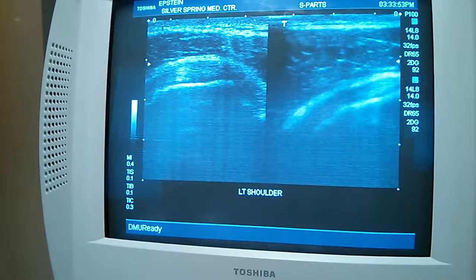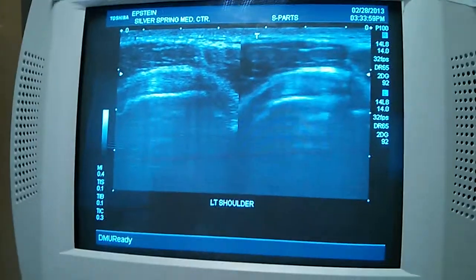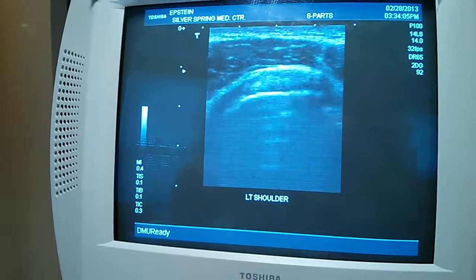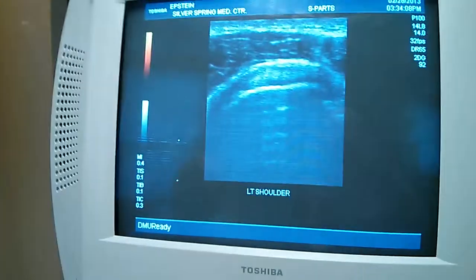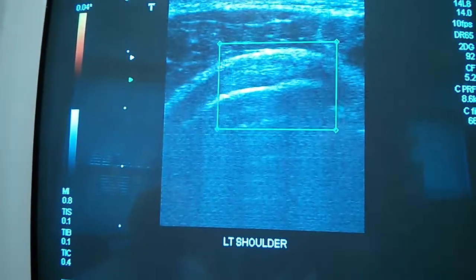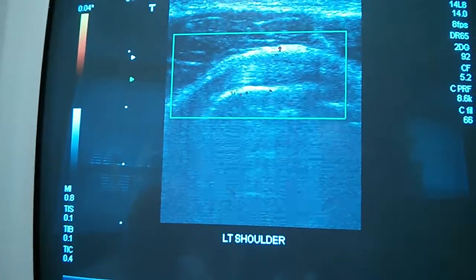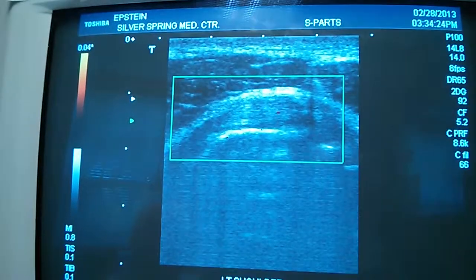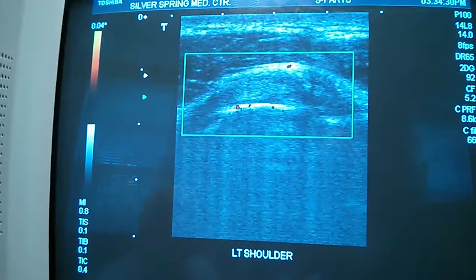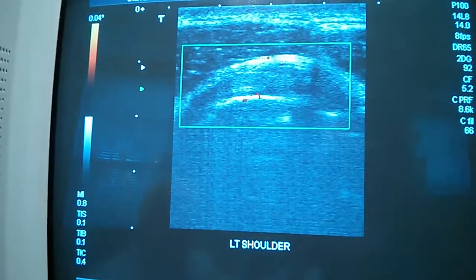The only thing that concerns me a little bit is the covering of the muscle. See the white line above the muscle? Yeah. This thing is a little bit thicker than it should be. Is that like scar tissue or something? So that suggests that it's inflammation. Oh, that makes sense. And this green box is Doppler, just like the weatherman. Anything that moves shows up as red or green or whatever it is. So you can see there that's blood flow. Oh, that's good, isn't it? Yeah, you want blood flow. But you can see it's sort of concentrated in that white area. It does look a little bit bigger than the below part.